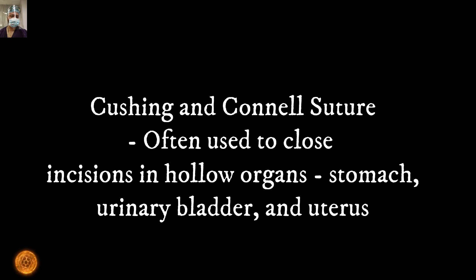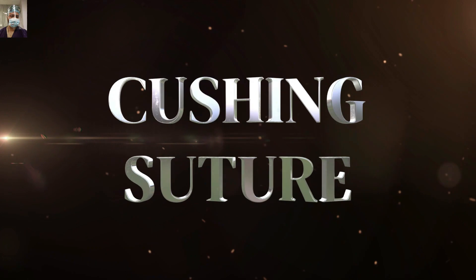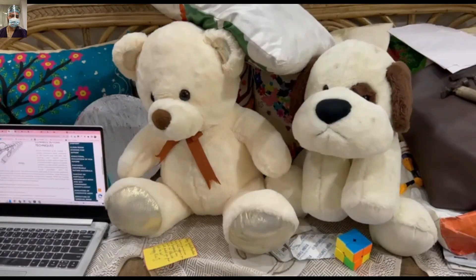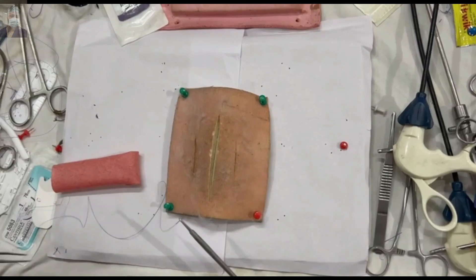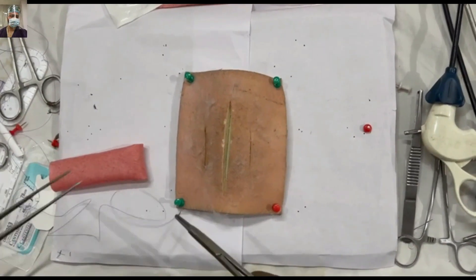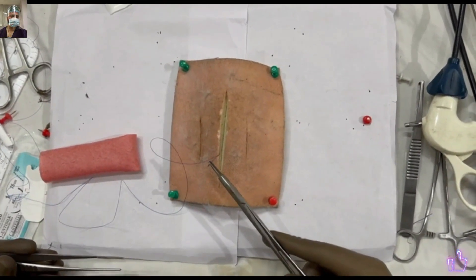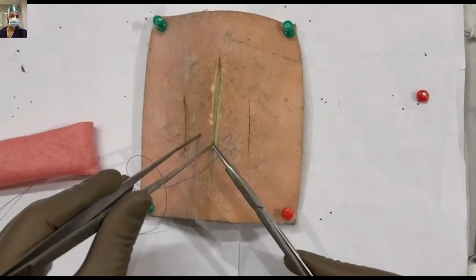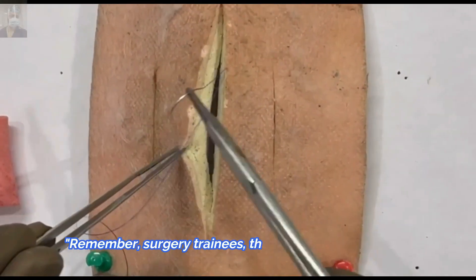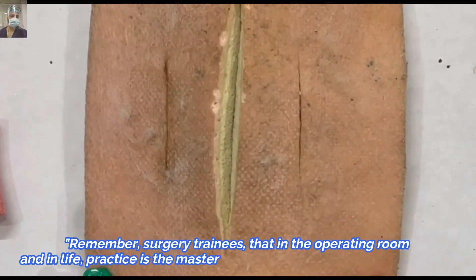In addition to intestinal anastomosis, these perfectly opposing inverting sutures can be used for the urinary bladder and uterus also. Now let's start with the demonstration on the suturing aids — this is our surgical canvas which we have discussed in the first part. I hope all of you have already made this canvas and practice on it at least once a day, especially in the beginning part of your surgical career. This will help you to refine your skills a lot.